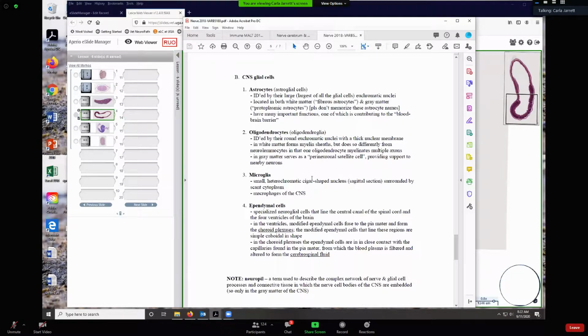These glial cells, at least the microglia, oligodendrocytes, and astrocytes, really require a special stain to see the entire cell. And that's true, really, in the nervous system. Why is that? Because in the nervous system, particularly the gray matter, we don't have any myelin and we don't have a lot of connective tissue.